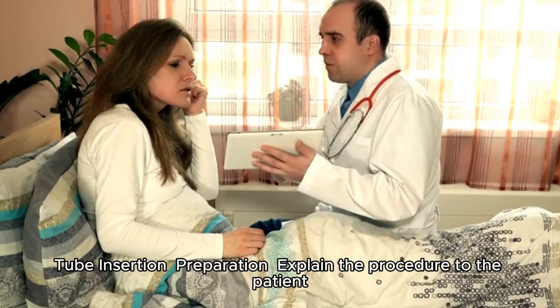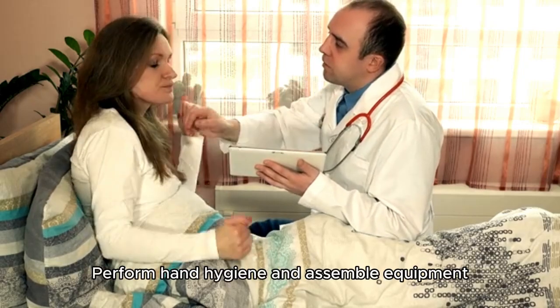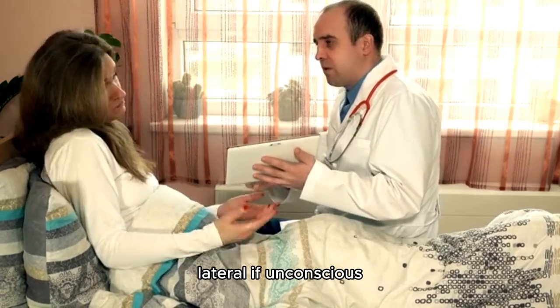Procedure for NG tube insertion. Preparation: explain the procedure to the patient. Perform hand hygiene and assemble the equipment. Position the patient semi-Fowler's if conscious, lateral if unconscious.